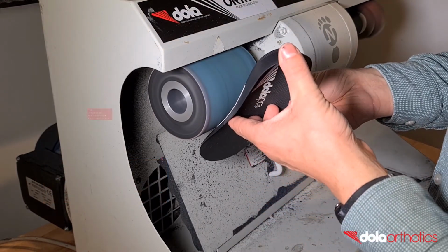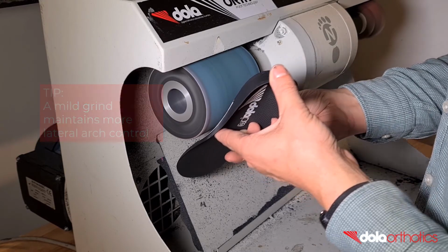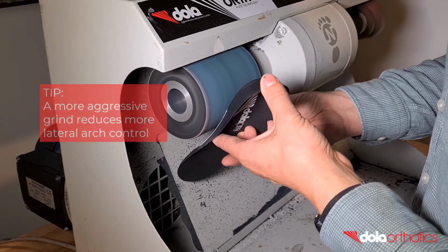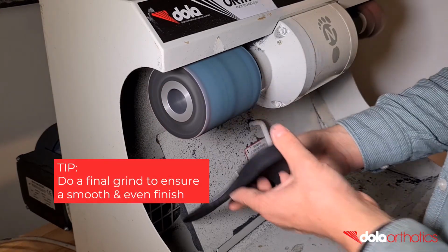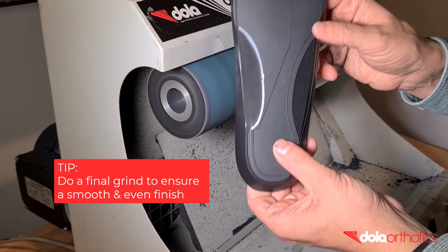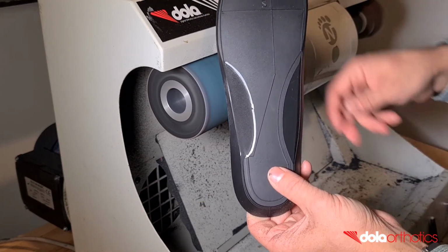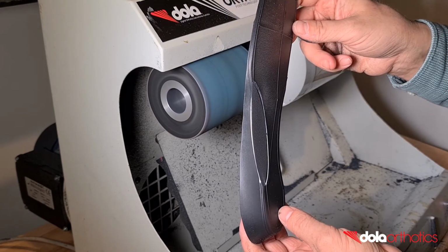A mild grind will keep the majority of the lateral reinforcement in place, and an aggressive grind will remove more lateral reinforcement, reduce the size of your flat plantar surface, and reduce the orthotic control. A full sweep of the edge against the grinder will ensure a smooth and even finish of the full arch. For an anterior grind, remove material from the anterior half of the arch. For a posterior grind, remove material from the posterior half of the arch.